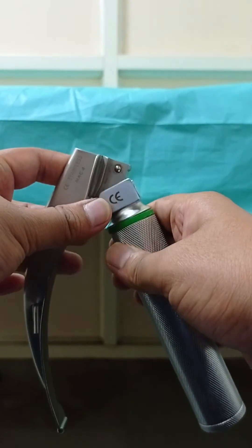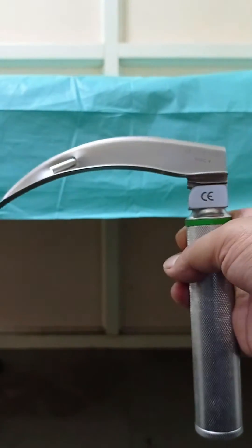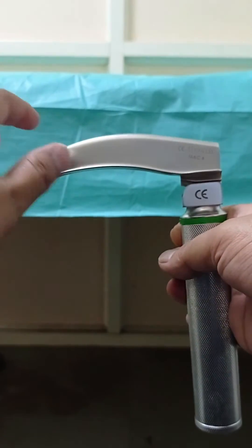When it is connected, you would see the light source is on. Now make the blade straight. Now the laryngoscope is ready to use.